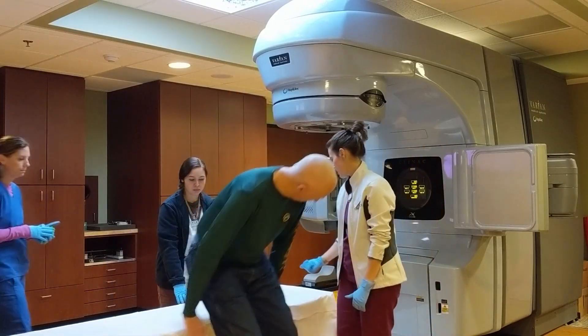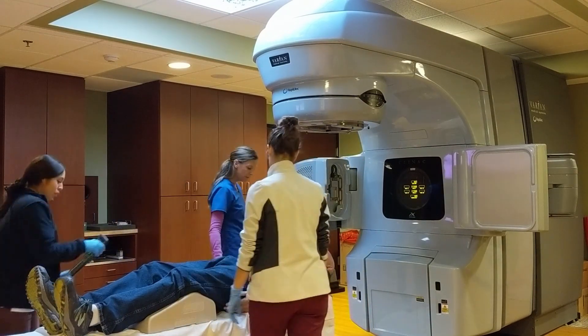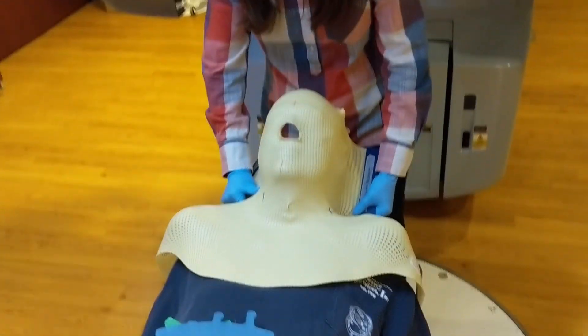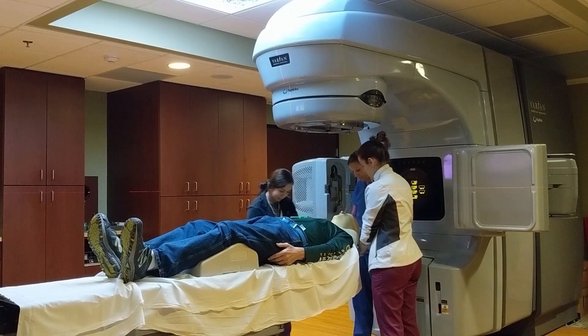I'm made comfortable on the table with a support under my knees, and the table is raised into position so that the radiation therapist can apply the stabilization mask. I found the mask very comfortable and often fell asleep during the procedure.